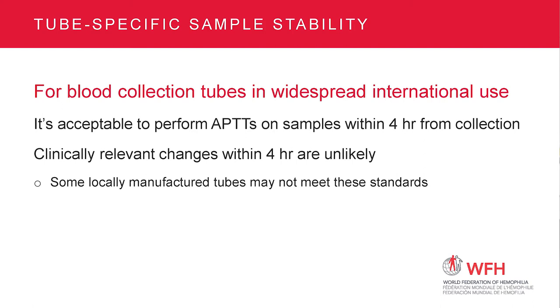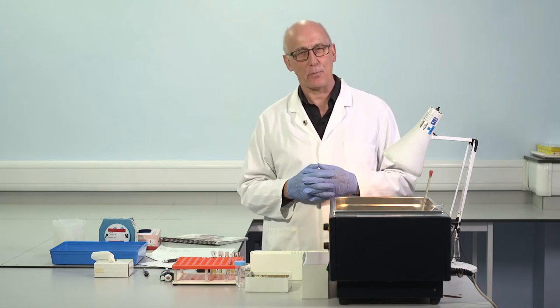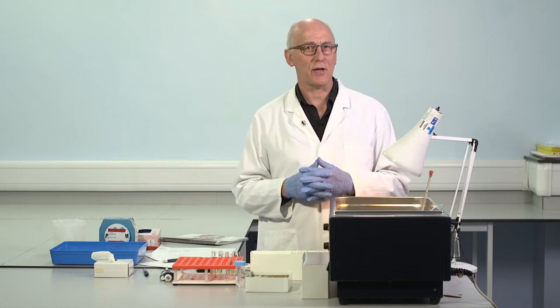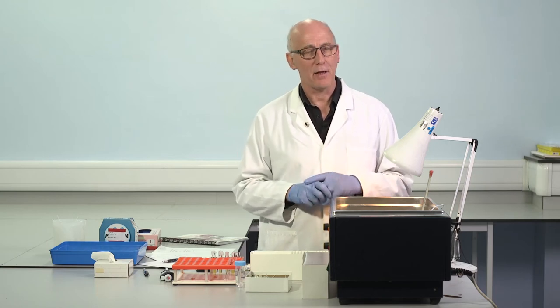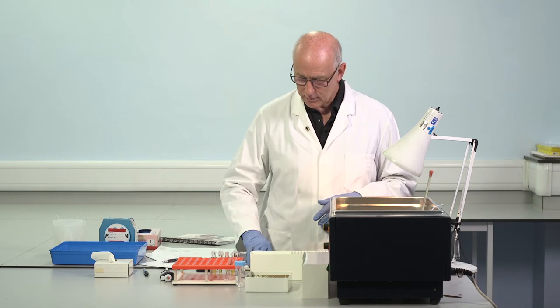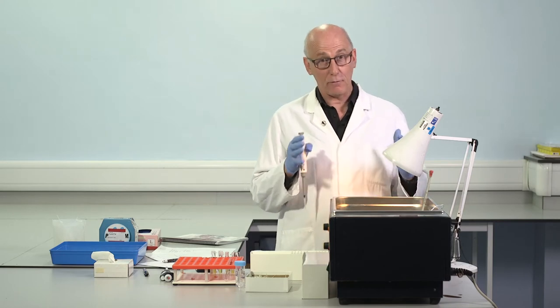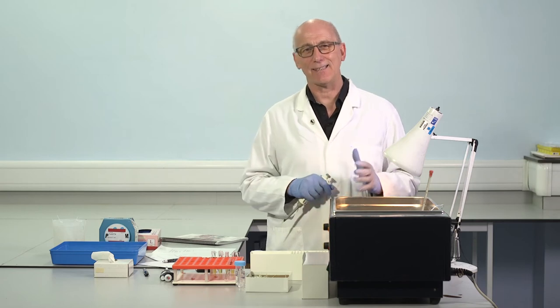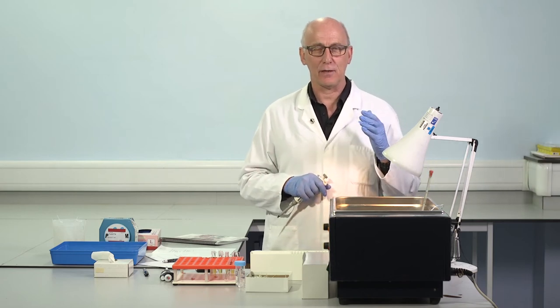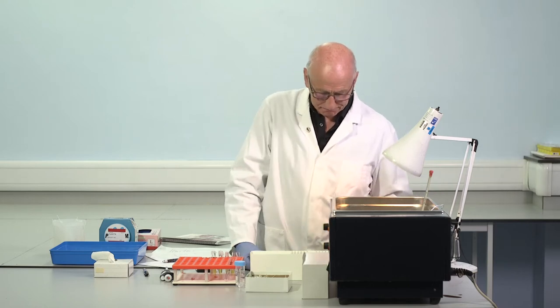At least if we're talking about bleeding disorders, as we are just now. Perhaps one important exception: if we were working with unfractionated heparin samples, there clinically relevant changes begin in the 2 to 4 hour period. So there we absolutely have to set a different criteria. For bleeding disorder work, haemophilia and so on, we won't see any important changes in 4 hours for the currently used blood collection tubes. So we've got that 4 hour window. But again, we want to treat samples from normal subjects in the same way as patient samples when we're constructing a reference range. We need to do the clots, and I'll come back to that point.